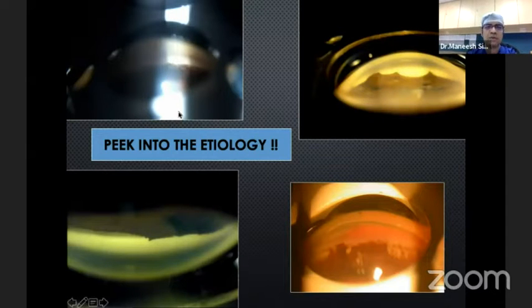If I share this slide, you can see there are 4 patients with different types of synechia. This is the first patient on the top left. You can see these point synechia, very typically seen in patients with primary angle closure glaucoma. On the right side, you can see these large tent-like synechia, often seen in patients with uveitic glaucoma. Lower left side, you have a broad synechia with the rest of the angle open, often seen in ICE syndrome.